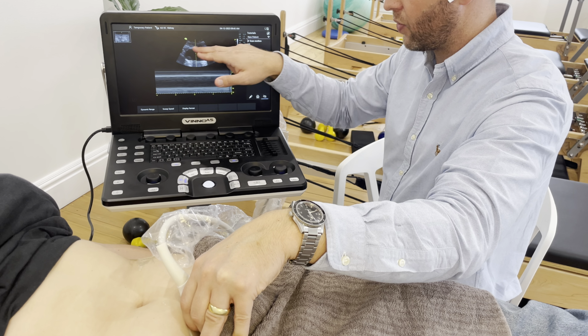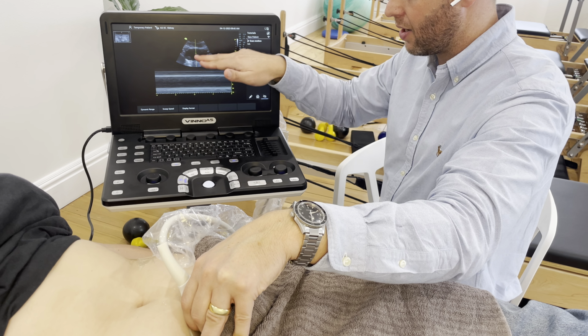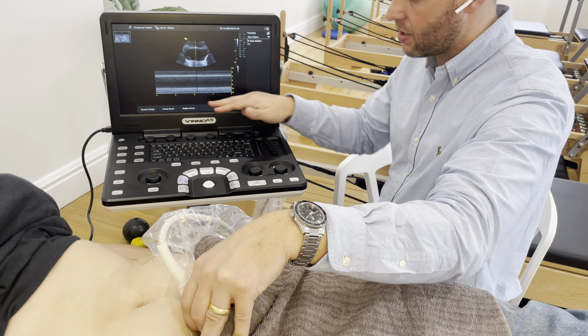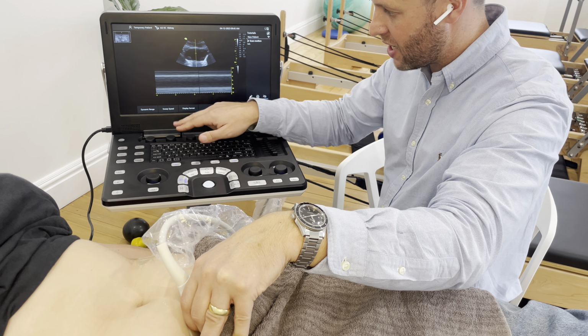So each of these white lines on the screen here correlates with a white line down the bottom here. So this first bright white line that we can see, that's the top of the bladder. This dark section in here is the bladder itself, and then this white line at the bottom is the bladder base. So if we're looking for an elevation, we're going to see it down the bottom here in the bladder base.